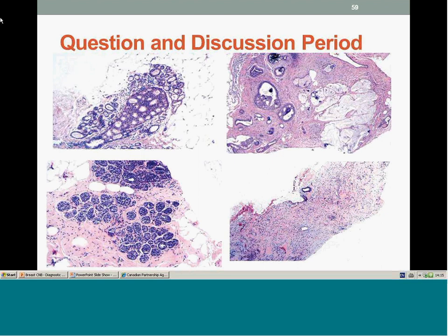The other thing, of course, is have you polarized? The standard thing we teach our residents is you've got to polarize all the cases because some of them are calcium oxalate and not calcium phosphate. Some people state which type of calcium it is. I don't go to that level of detail because I don't think the clinician cares. But I will polarize them.